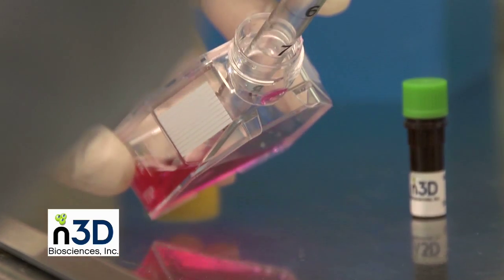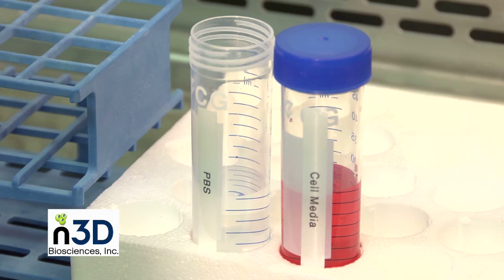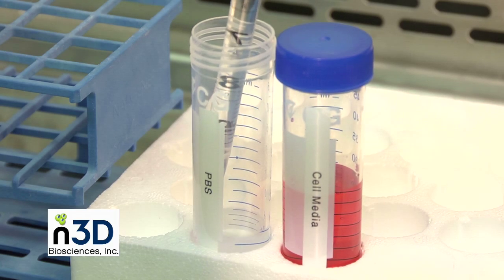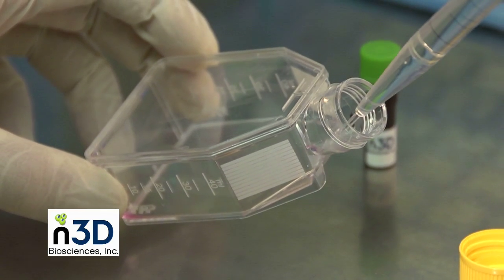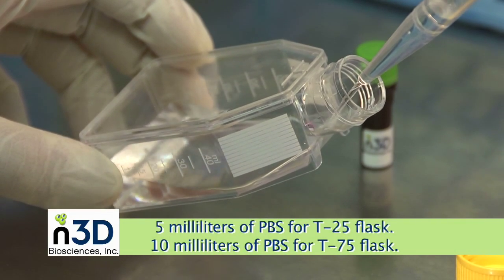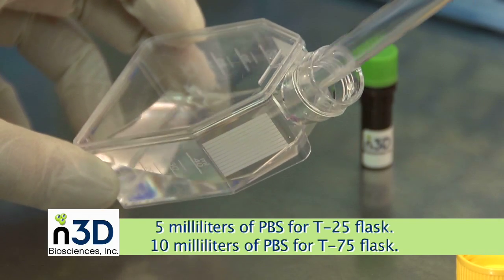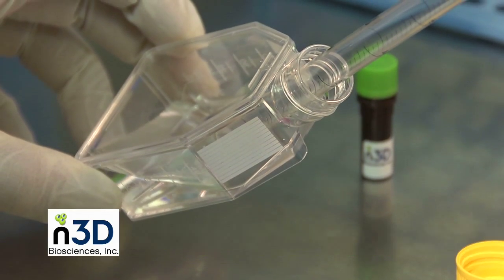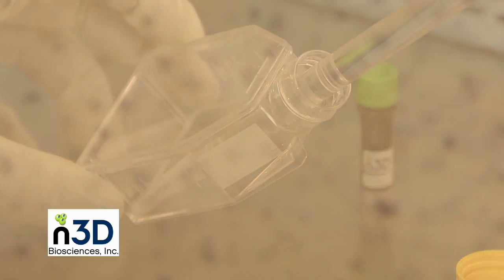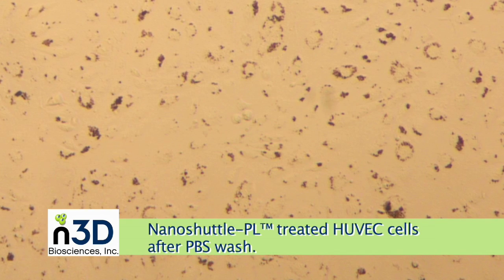After the incubation with NanoShuttle PL, remove media and perform a PBS wash. The PBS wash will remove any residual media and unbound NanoShuttle PL. After adding PBS to the flask, gently agitate it. We recommend 5 milliliters of PBS for a T25 flask and 10 milliliters for a T75 flask. Next, remove the PBS with a pipette and discard it. Here we see a common cell type, HUVEC, in a flask after the PBS wash.